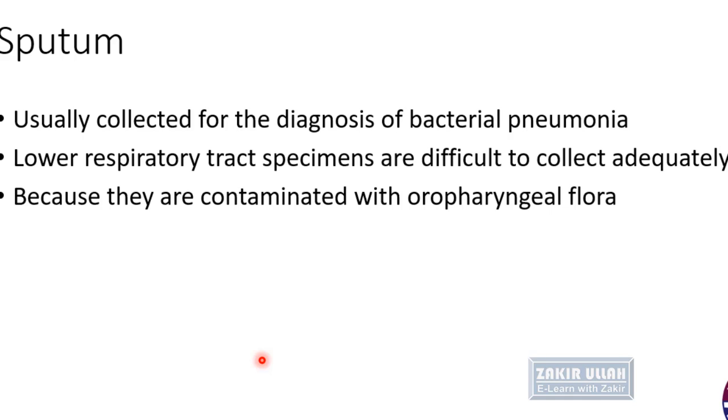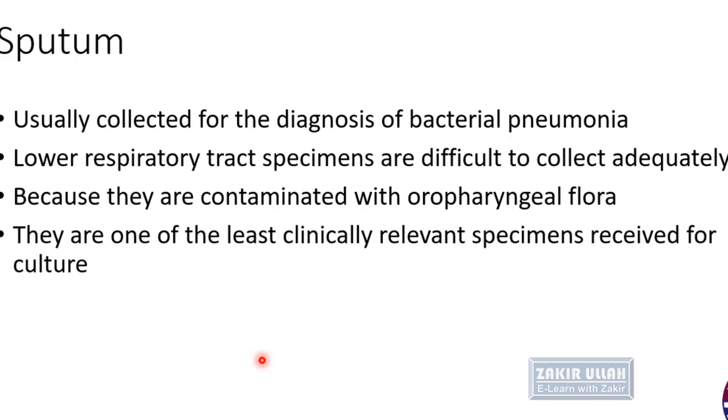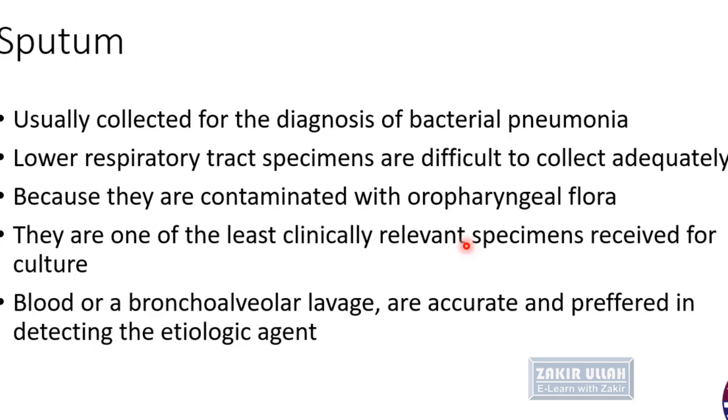These specimens are usually contaminated with the normal flora of the oropharynx, the laryngopharynx, or the normal flora of the pharynx. They are one of the least clinically relevant specimens received for culture due to the presence of the normal flora.